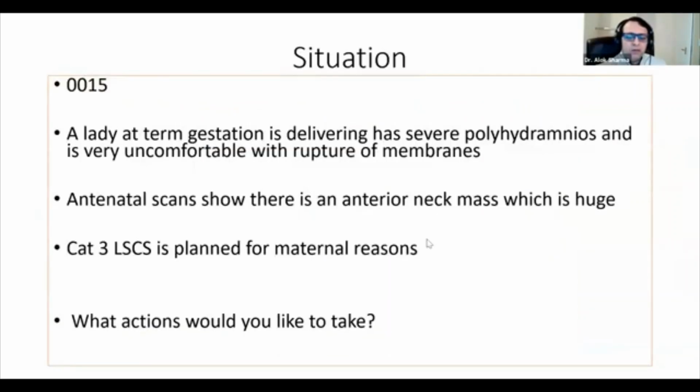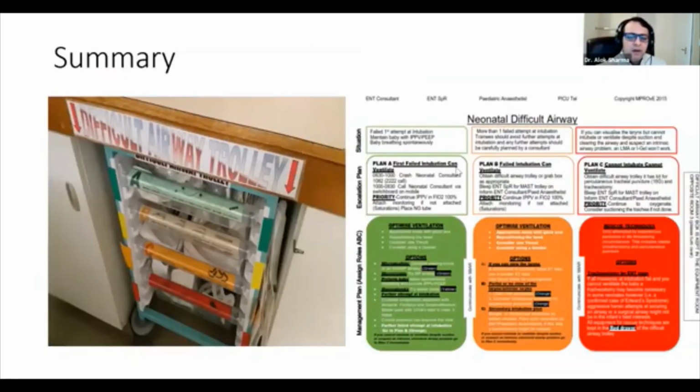So if you look at our pathway that I've got over here, the pathway basically provides options for trainees and clinicians in pediatrics and neonatology to manage the various situations without intubation. So for micrognathia, you can use an oral or a nasopharyngeal airway. You can put the baby on high flow. Similarly for microstomia. For a baby with macroglossia, you can use a broad blade.